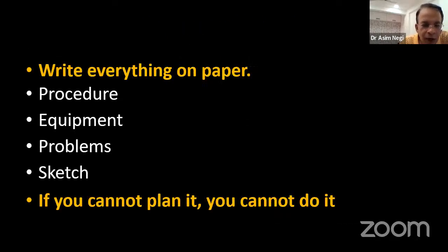Keep a variety of implants available: locking plates, distal radius plates, recon plates, 2.4 and headless compression screws, all those things may be required on the table.